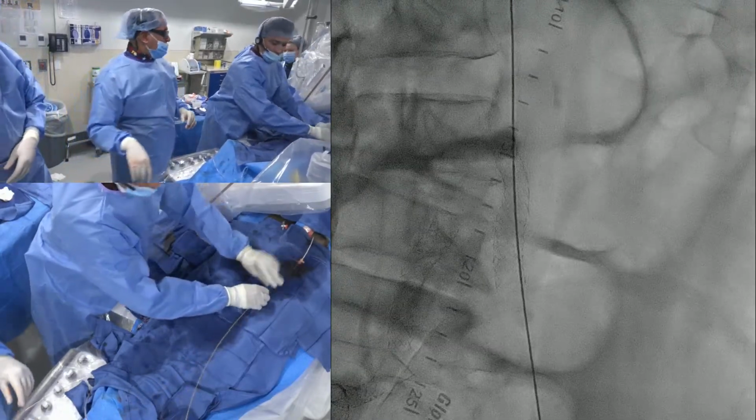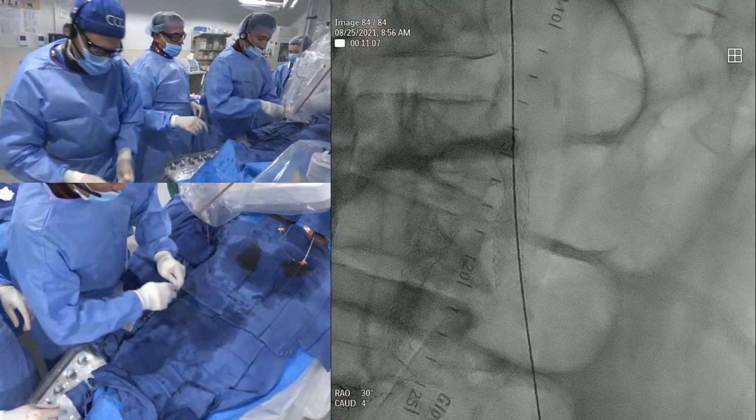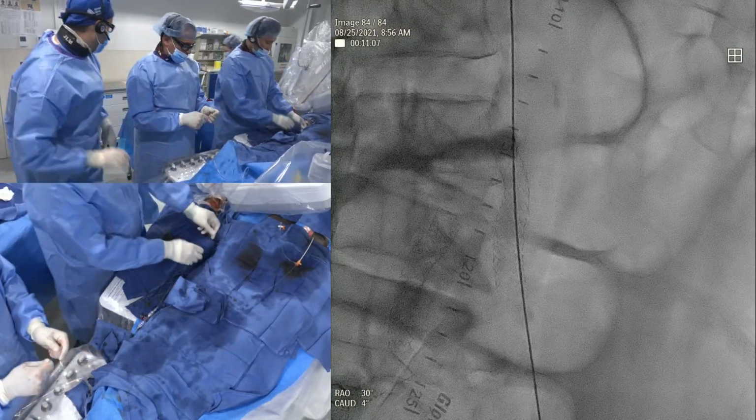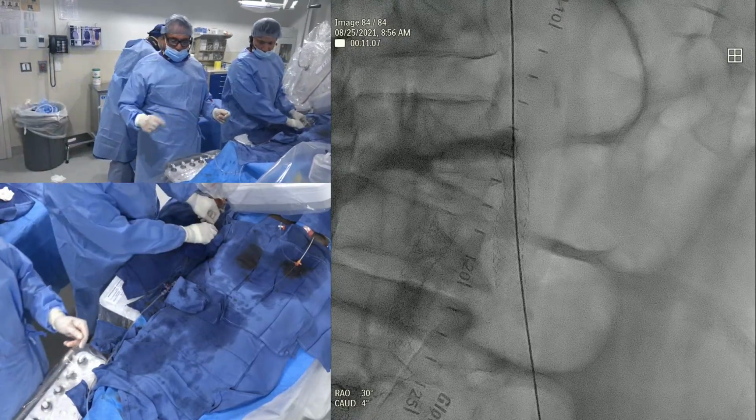You'll be able to do, huh? He's okay? Yeah, it's fine. There's a lot of loop here, so it's still nicely anchored, because I kept a loop. Yeah, Sparta cord? I can get you Sparta cord. Oops, I dropped the... Do we have a Sparta cord?